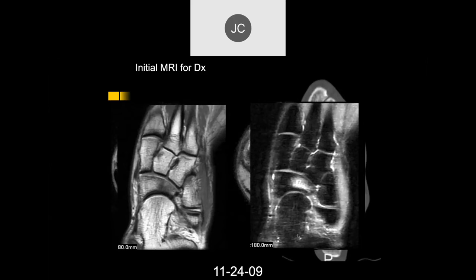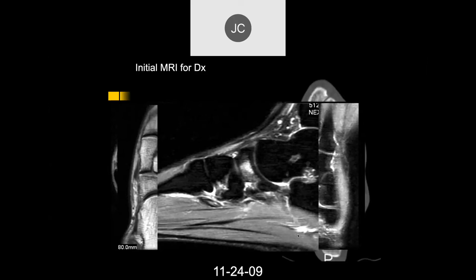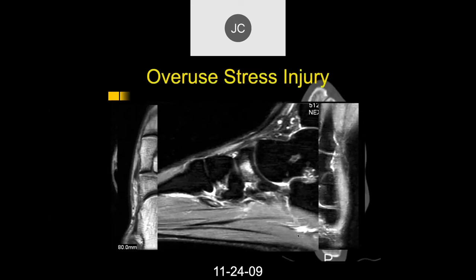Now we can see focal edema in the navicular. This turned out to be an overuse stress injury in someone who started running. Injuries to the navicular — it's one of those bones commonly injured. Historically these injuries were called osteonecrosis, but we now know the vast majority are actually due to repetitive trauma and trabecular bone injuries rather than infarcts. It's a lot like the lunate — both are central bones. If repetitive trauma continues, you can get compression and collapse of the navicular. These need to be recognized as overuse repetitive traumatic injuries, not osteonecrosis.